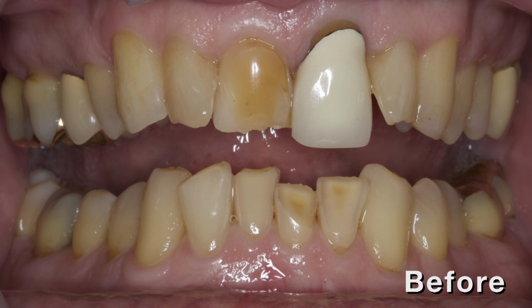this PFM. When we discuss bilayered restorations, we often see failures with the weaker veneered feldspathic porcelain, but without the compressive and shearing forces experienced in the posterior region, this PFM stood the test of time of nearly half a century, which is really amazing.